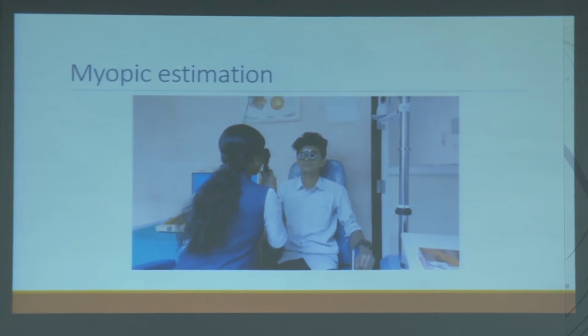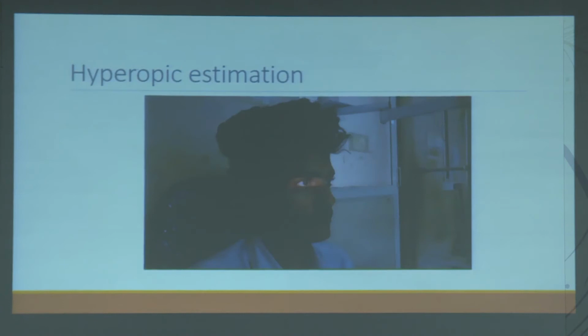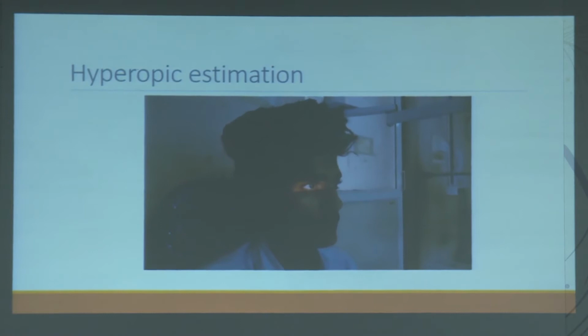So this I have already told. In hyperopia also, depending on high hyperopia, if you don't get a reflex, by adjusting the sleeve of the retinoscope, probably you can have an assessment of the hyperopic status.